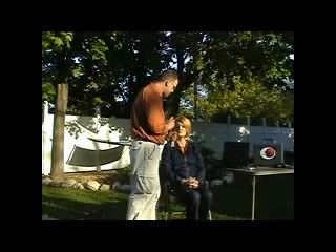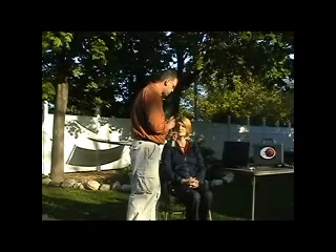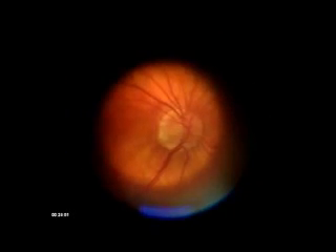Have the patient looking straight ahead. Bring the camera in until you can see the red reflex. You will want to compress the cup onto the eye about halfway, just as in normal Panoptic use. This will give you a good view of the optic nerve. Simply press your button to take your photo.